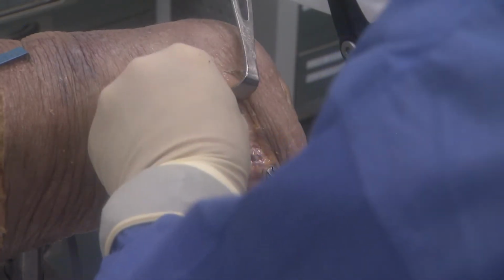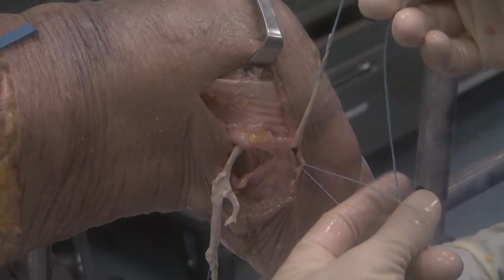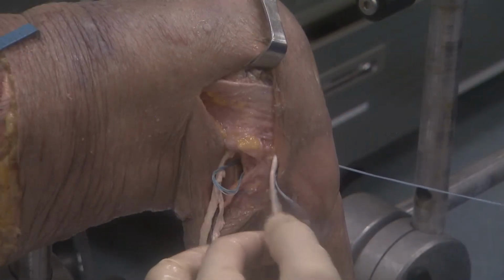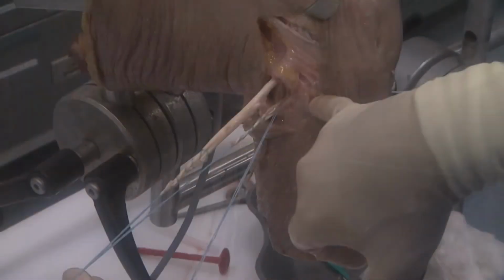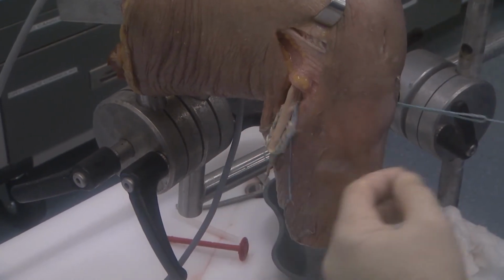Now I do the same thing for my LCL. Now the LCL is more superficial to the popliteus, and then I've already placed a passing suture in the fibula, so I can now pass this. Now I'm ready to pass both of these into the posterior aspect of the knee and then out through the tibial tunnel.